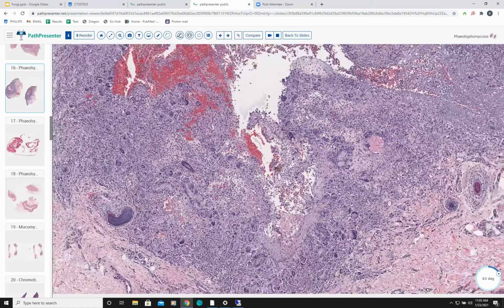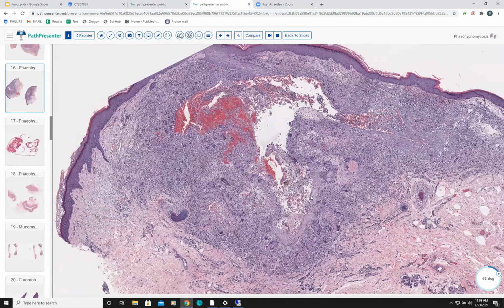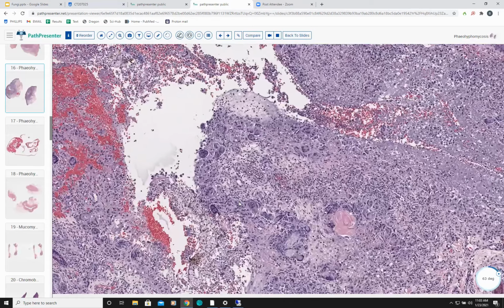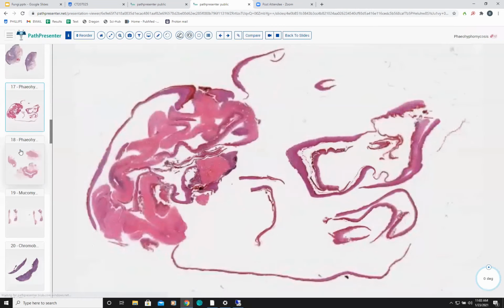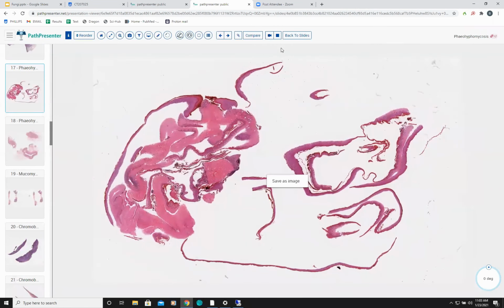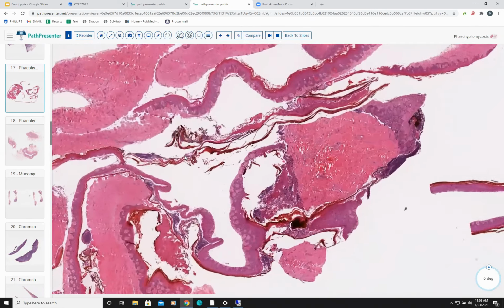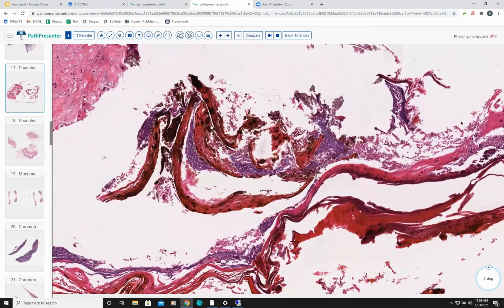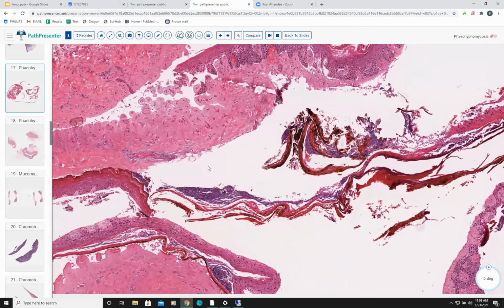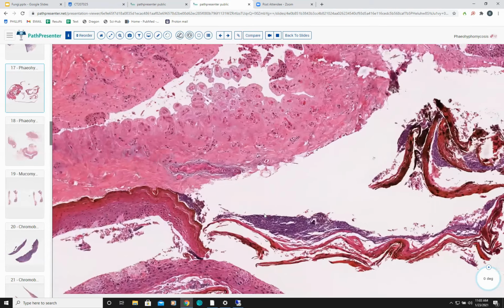But you can see on a day when you haven't had your Wheaties, this could come in as a clinical nodule. This could go as response to a ruptured cyst. So in these cases where we just report ruptured cyst, be careful that there's not phaeohyphomycosis. Can be really tricky. This was a case that also looks like fragments of an epidermoid inclusion cyst. And the clue here, and these are hard to see, is there's this pigment, and when a PASD stain was done on this one, again, this had septate hyphae and pigmented hyphae, and this was phaeohyphomycosis.